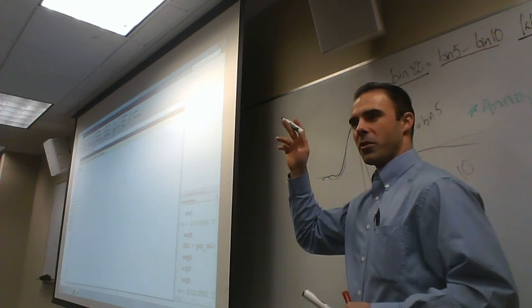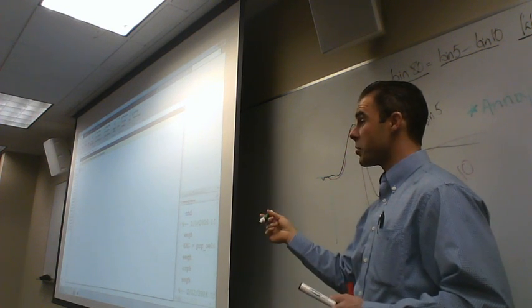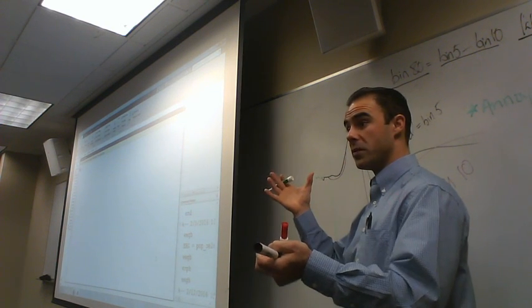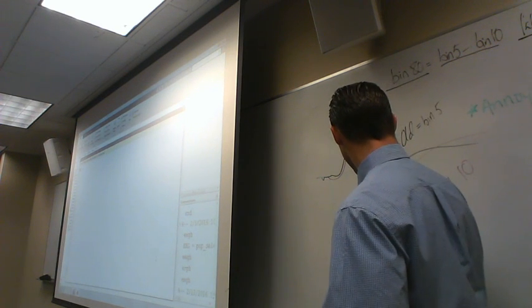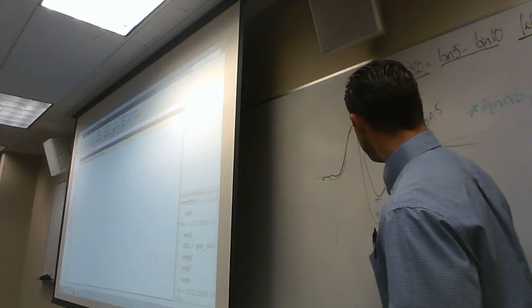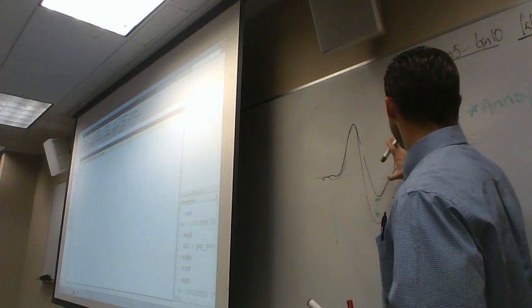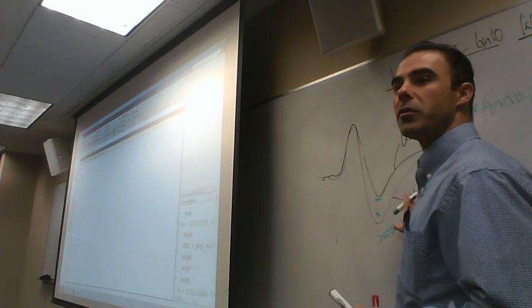So let's say that this green marker is our difference wave. Now remember, this is the subtraction. We went back a couple lectures ago and talked about the LPC and the FN400. When you plot the topographic maps, the big 3D color heads, those are representing the subtraction between this. So this might be the FN400 here, right? This difference between here and here. So you're subtracting these two. Another way of thinking about it is saying, show us everywhere where this black line, or the old condition, is greater than the new condition.